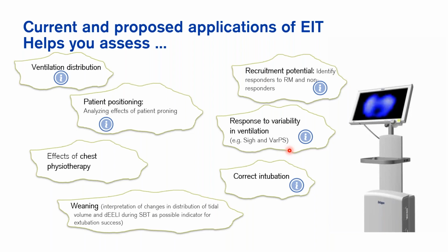So PulmoVista has this image that it is a tool that can be used to evaluate the recruitment maneuvers. But actually, PulmoVista can be used in a lot of various cases.